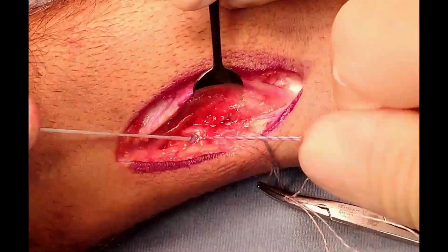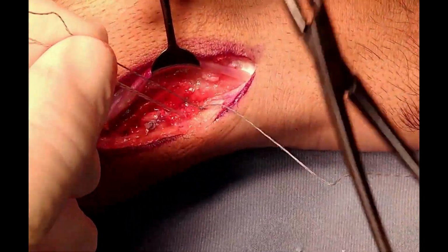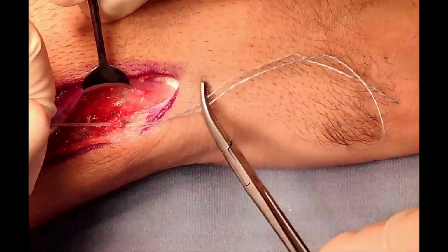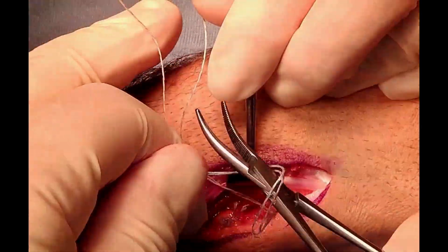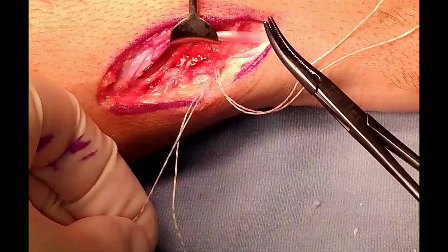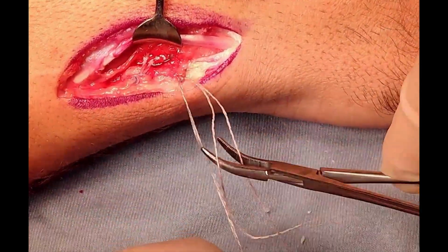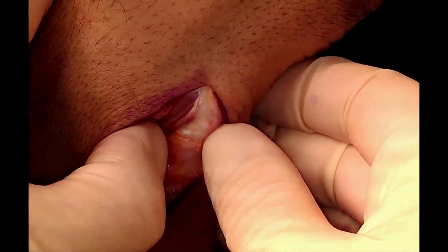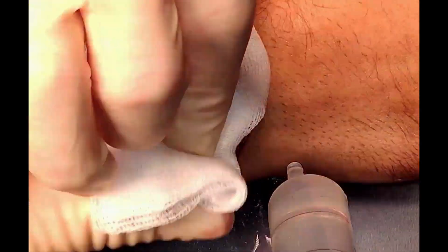the ECU. So to summarize, this is a young patient who had a ganglion cyst under the EDM, pushing away the ECU, involving the DRUJ, causing the patient symptoms of pain and weakness, and snapping of the ECU out of its place. We excise the ganglion, we reattach the dorsal radio-ulnar ligament back to the ulna, and then we stabilize the ECU with a double row of anchors utilizing the subsheath and the extensor retinaculum.